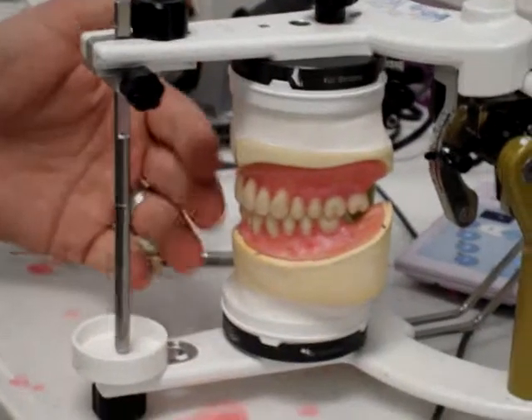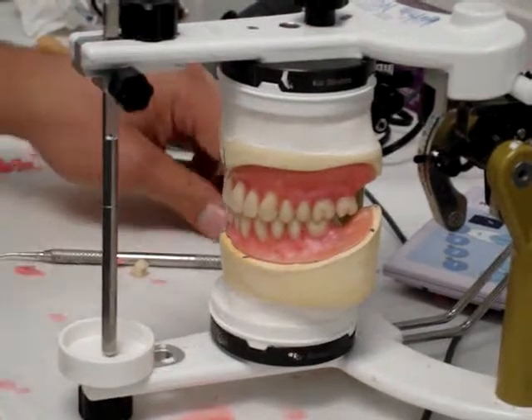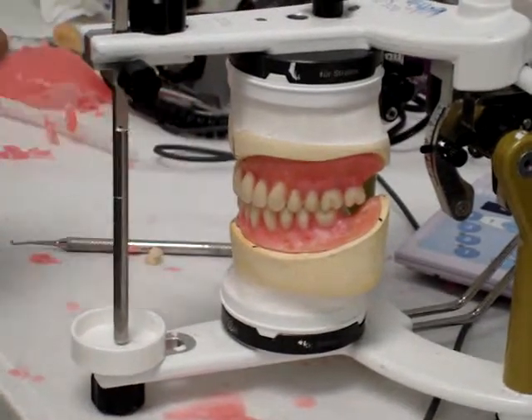Worst case scenario, if you're running out of time and you have everything else good — all your excursive centrics are good — I just make these super thin and set them in and leave them out of excursion. But only do that if you can't set them right. If you can set them right, set them right.